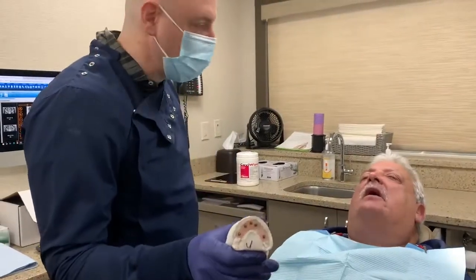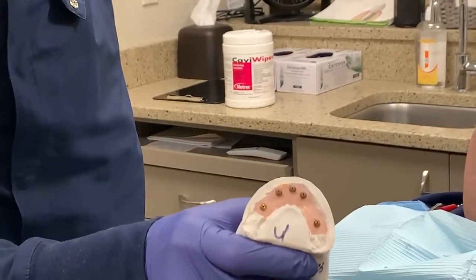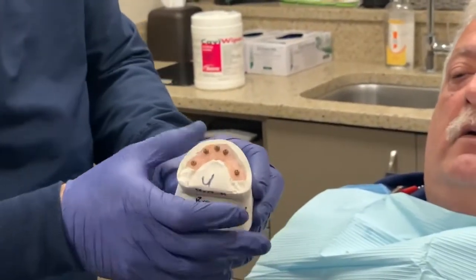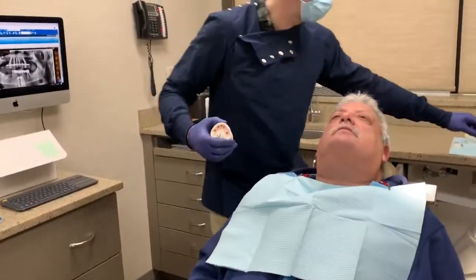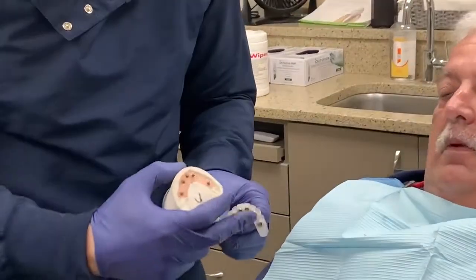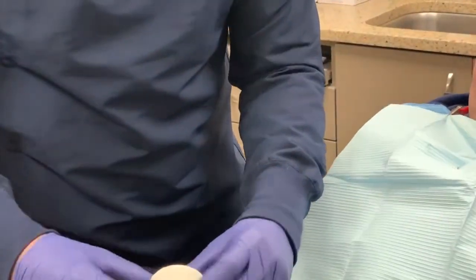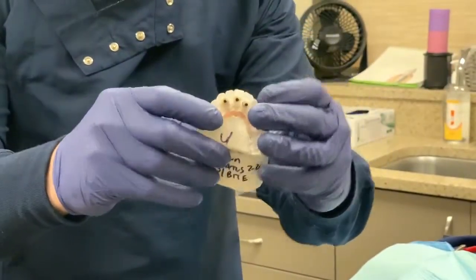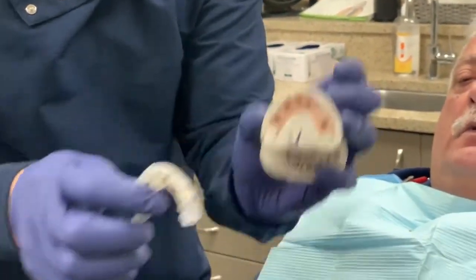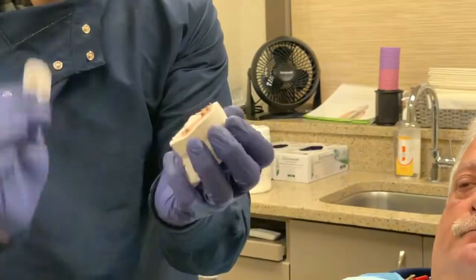So this is the soft tissue cast that we captured from the last soft tissue pickup impression and the occlusal registration. So essentially it's a back pour into our Duke prosthesis. If you recall, there was impression material that I squirted underneath of it, and then it was back poured onto this. And now this becomes our master cast, the master cast that the prosthesis is going to be fabricated on. I know it doesn't look like a traditional cast, hard tissue or soft tissue cast, but that's what it's going to be.